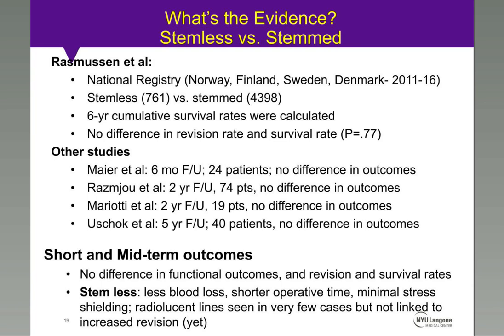Rasmussen et al. published their data from the National Registry that was contributed by Norway, Finland, Sweden, and Denmark with patients enrolled between 2011 and 2016. They compared 761 stemless designs to 4,398 stem components. Their 6-year cumulative survival rate did not show any difference between the stemless and stem design, and there were no differences in the revisions noted.